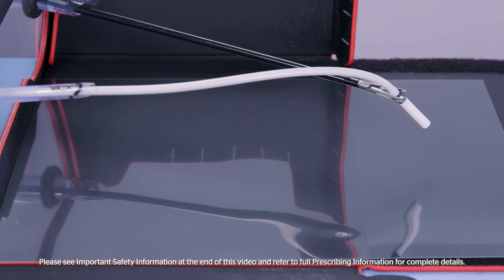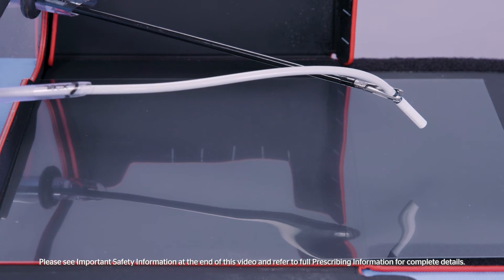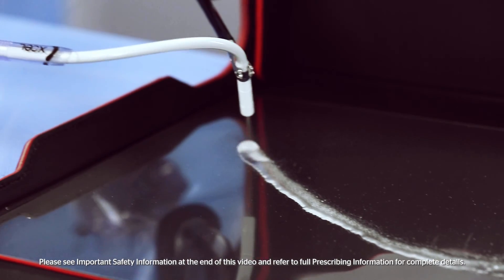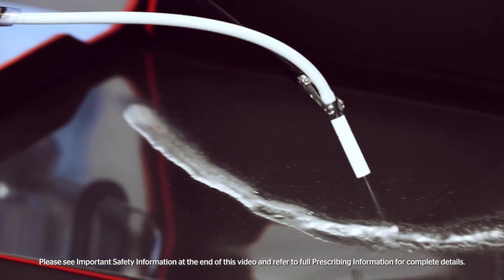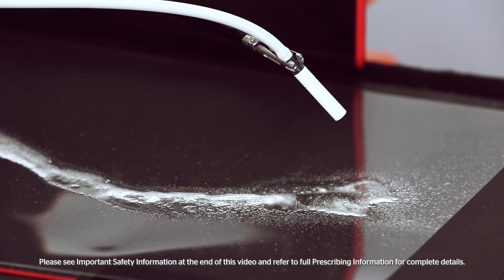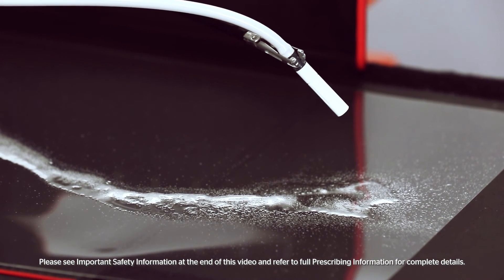Position the airless spray tip two centimeters or more from the target tissue. Apply firm, even pressure to the plunger to spray the fibrin sealant. Not providing enough force may clog the tip. Increase distance accordingly to achieve desired coverage of the target area.